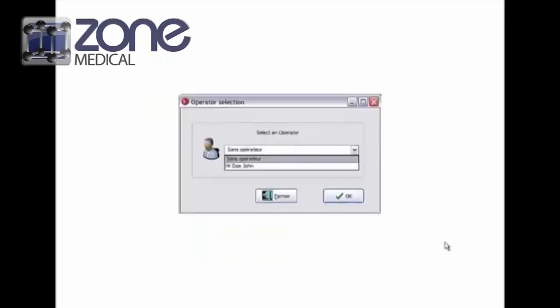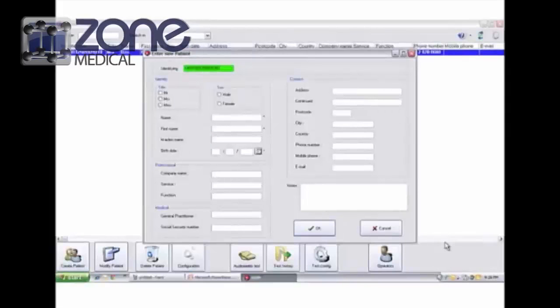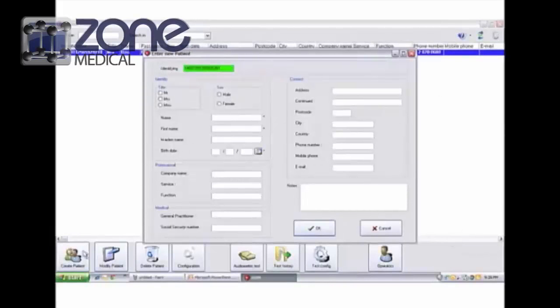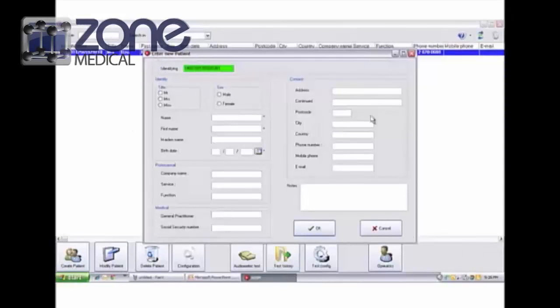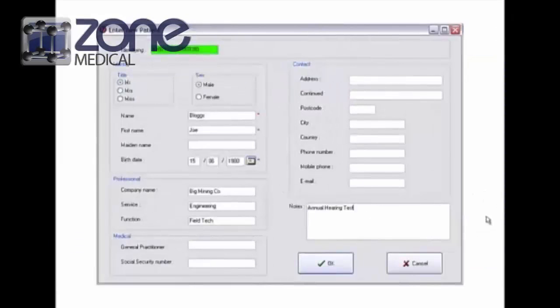This will take you to the home screen. If you click the create a patient icon, it'll open up a new window where you can fill out all the details. I've just created a patient here.